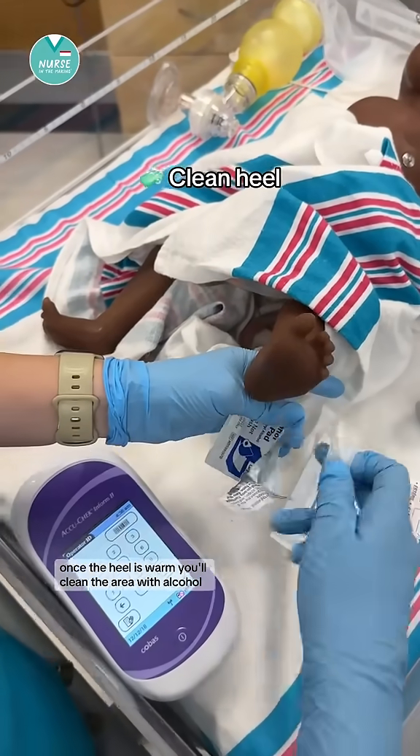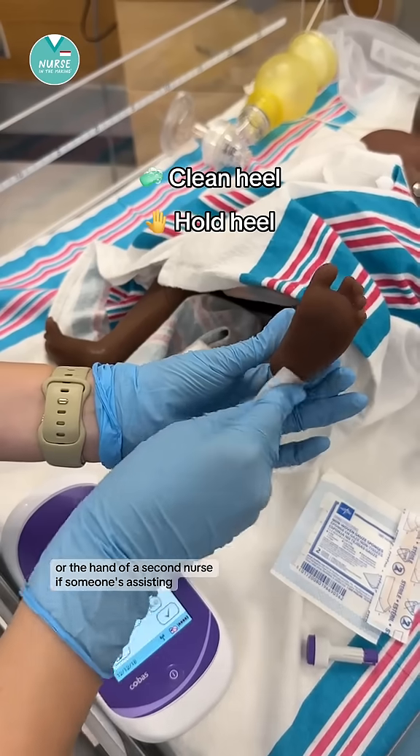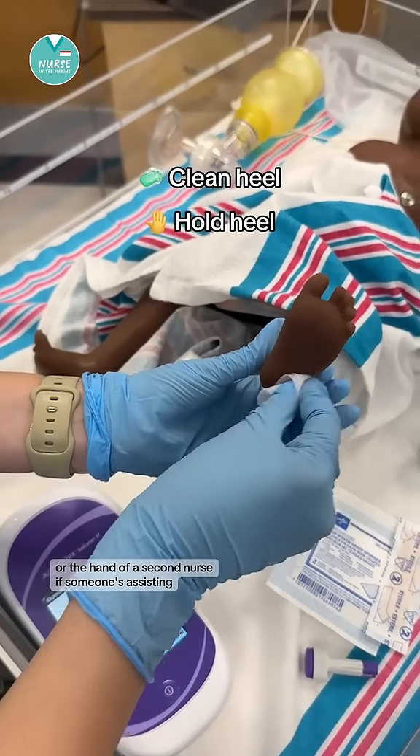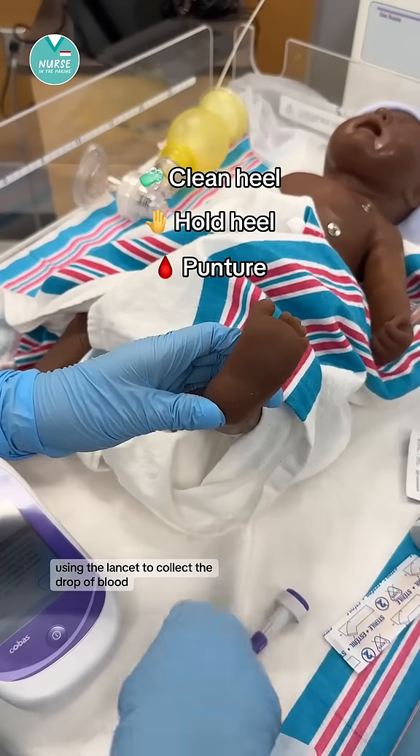Once the heel is warm, you'll clean the area with alcohol. The foot is held by the nurse's free hand, or the hand of a second nurse if someone's assisting. The heel is then punctured on the outer area of the heel using the lancet.